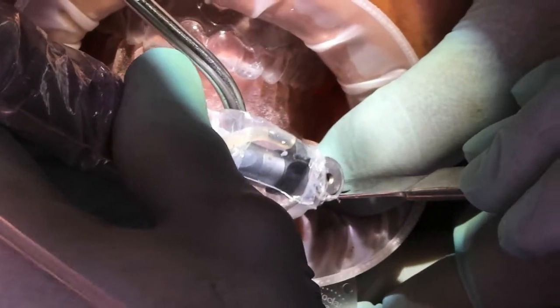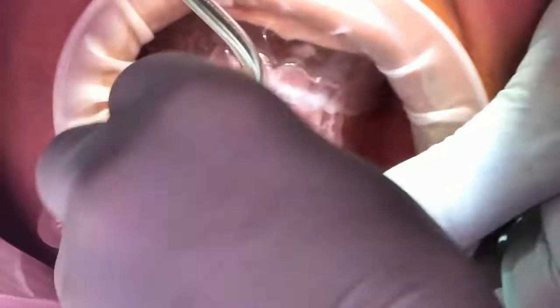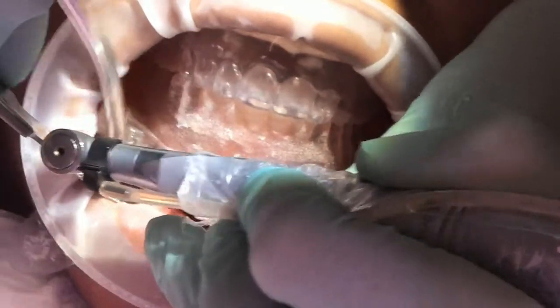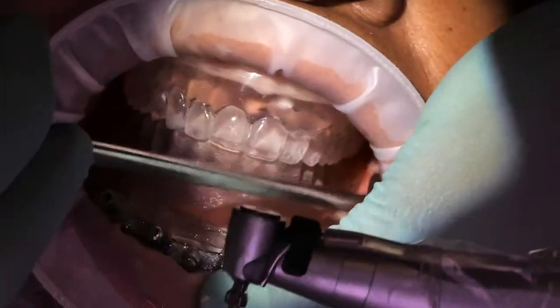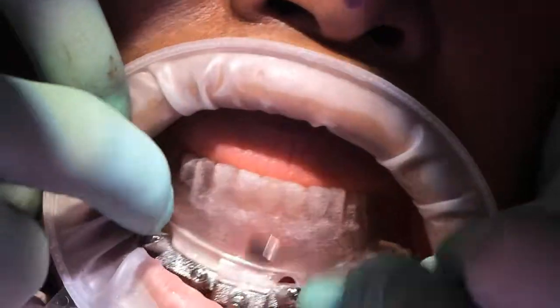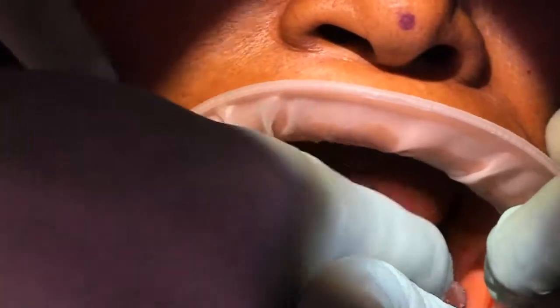Drill all the sites — mandibular and maxilla — and place pins in one at a time. With all the sites drilled and the pins seated, remove the mandibular pins, remove the fixation base and pin guide, and the mandibular is now on hold until the maxilla is finished. In the maxilla, remove all the pins and the fixation base and prepare to lay the flap. You'll notice in this video that Dr. Towell, who is performing the surgery, lays a labial flap. This aids in simplified suturing later, as the bone reduction will allow the labial flap to be folded over the ridge.